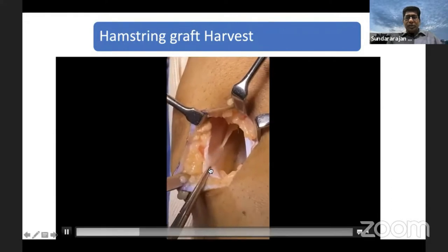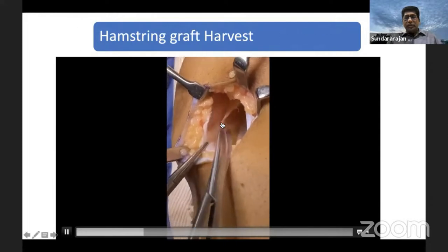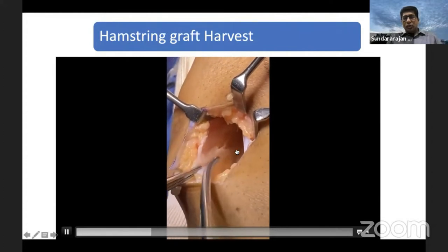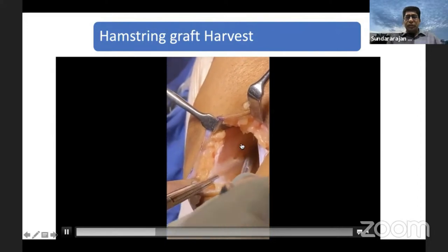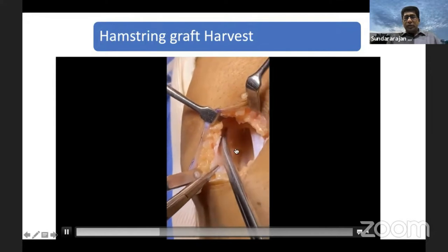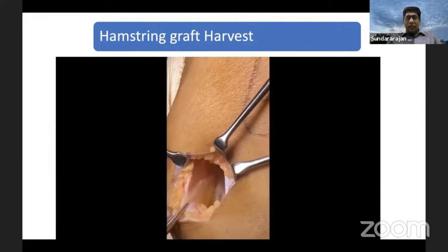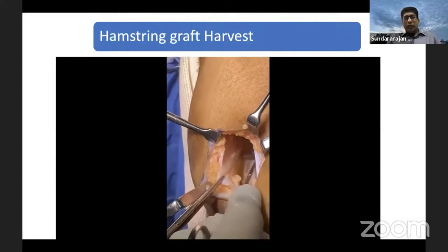What you are seeing here is the gracilis. Gracilis is proximal and semitendinosus is distal. Gracilis goes upwards and semitendinosus goes more downwards and posteriorly. That is how you differentiate your gracilis and semitendinosus. Once you have identified both gracilis and semitendinosus, sometimes a quadrupled semitendinosus is more than sufficient. If it is not sufficient — if you don't have enough thickness of around 8mm — then you can take both grafts.